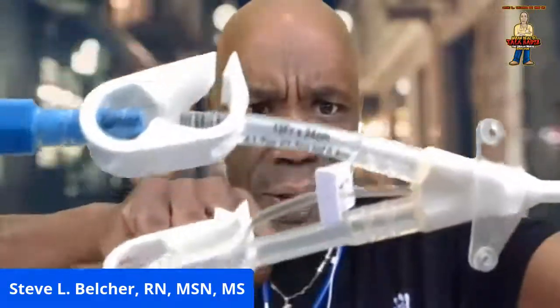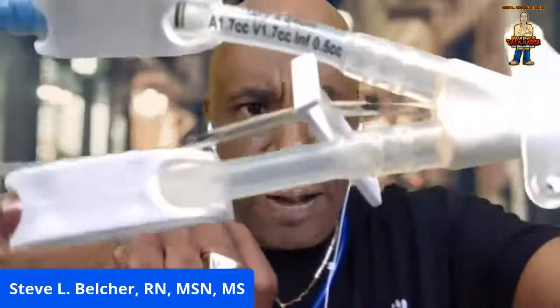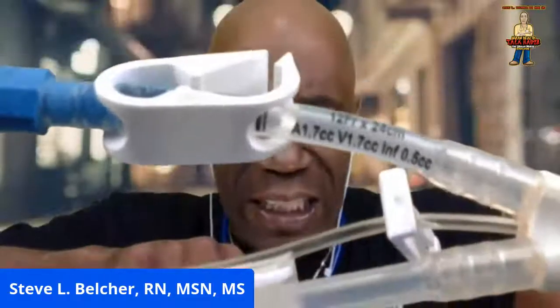How is the medication, the clot buster, given? As I mentioned, we draw it up. It comes in a powdered form in two vials, right? We put bacteriostatic water or sterile water, draw it up, put it in there, mix it up, right? Get the 3cc syringe, clean out the stopper with alcohol, draw it up. Usually it's 2cc's, right? Or the amount of the length of the catheter, as I showed you. In this case, 1.7 for each limb.